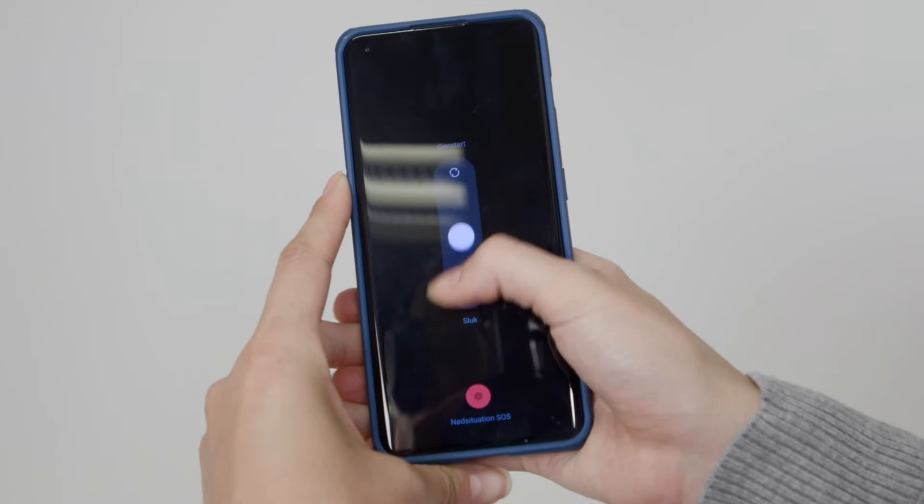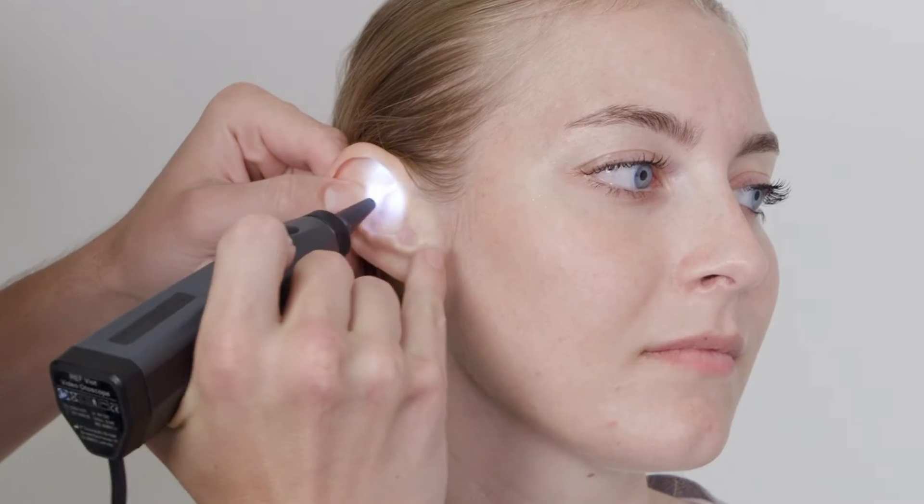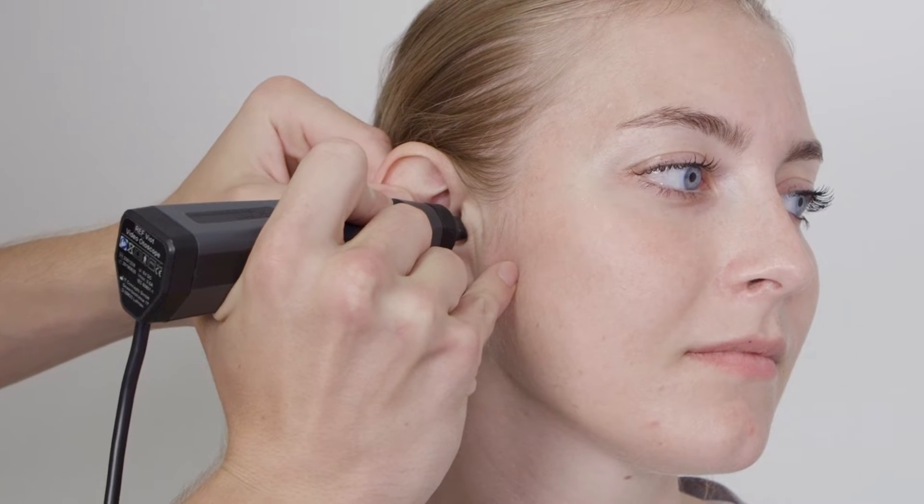Before you start testing, instruct the patient to turn off all their electronic devices in order to minimize noise. Now look in your patient's ear to ensure no excess cerumen is present.